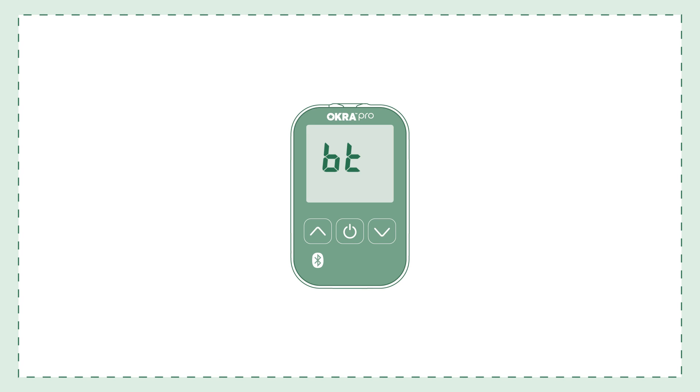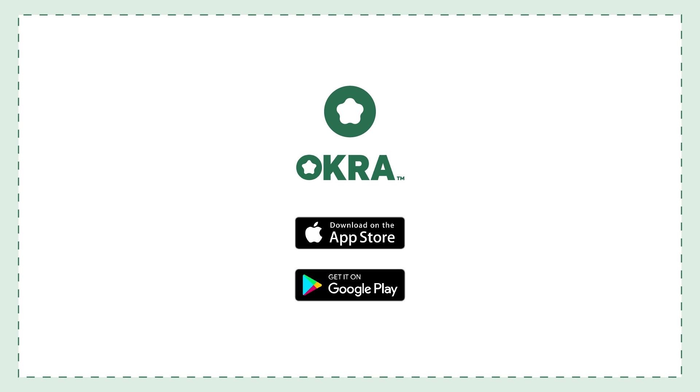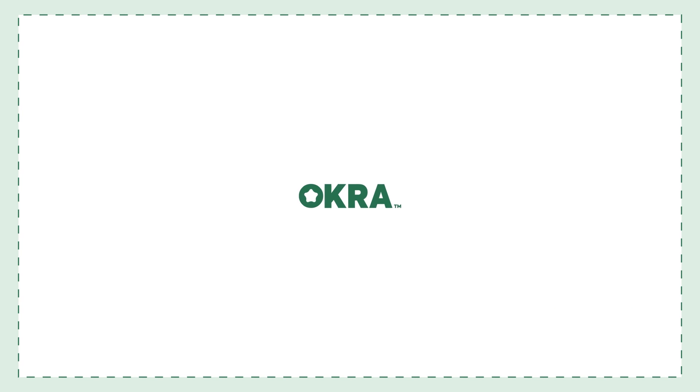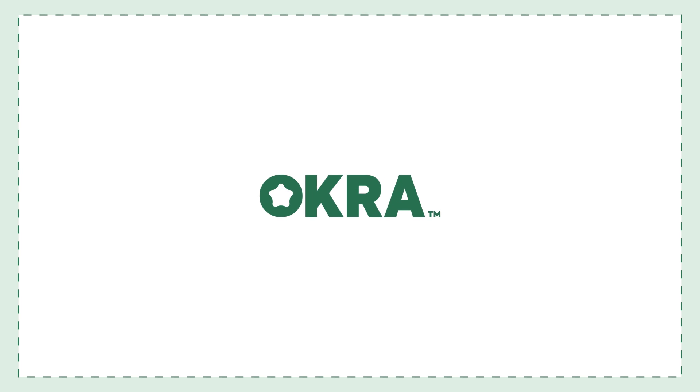After testing and removing the test strip, the Bluetooth pairing mode will automatically turn on. Pair your meter with the Okra Pro mobile app to sync your results. You can find additional instructions on syncing your Okra Pro to the app in the Okra Pro app video. Thank you for choosing the Okra Pro Blood Glucose Monitoring System.